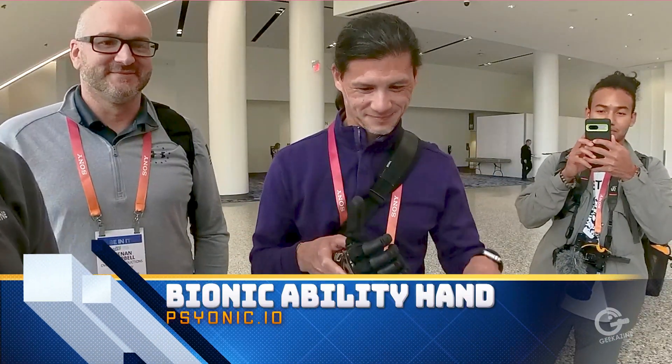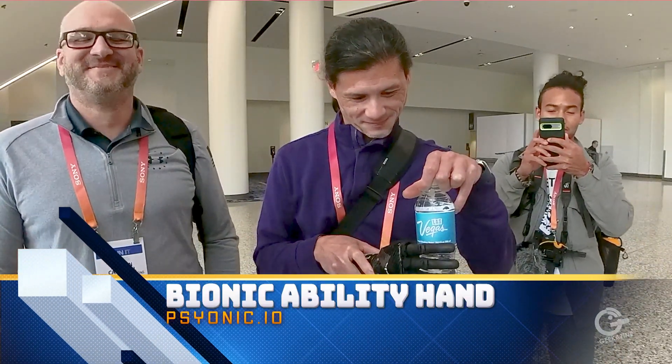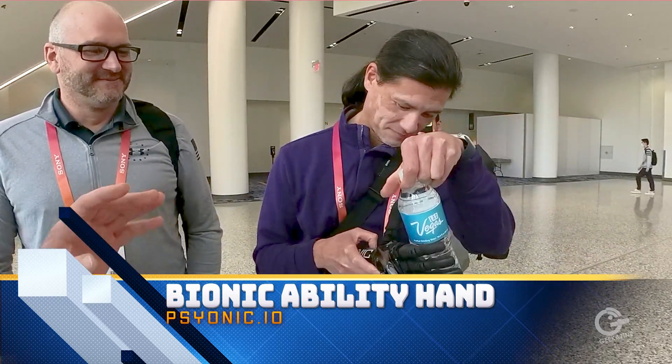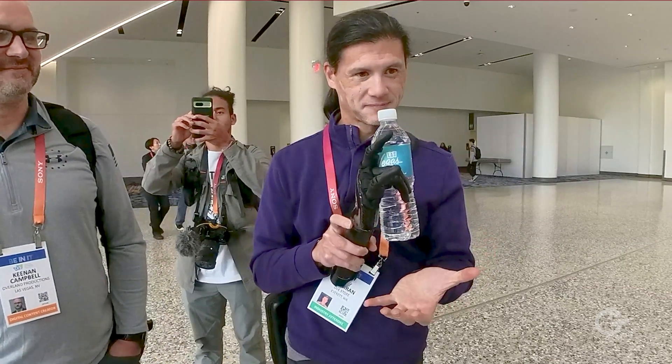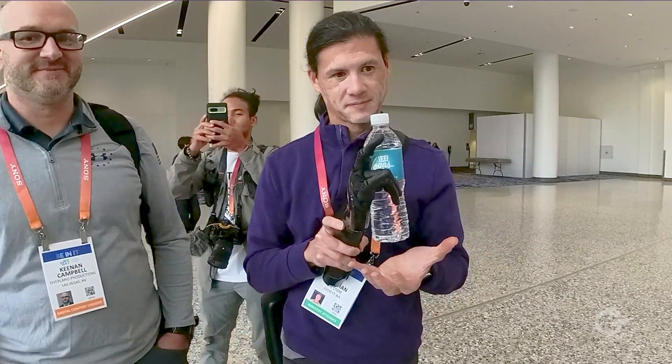They're doing a great job here at CES because they caught our attention really easy, really quick. So what is this called? Our company is Psyonic and this is our Bionic Ability Hand that's out on the market. It's an FDA-registered bionic hand for people who are missing their hands.